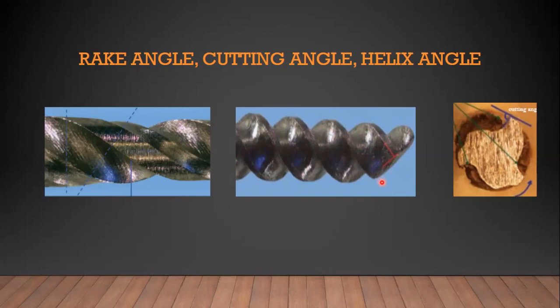Now, if the diameter of the file increases from the file tip towards the handle, the flute will become deeper, resulting in a core taper that is different from the external taper. Like Hero Shaper Gold, they are provided with a change of helix angle from tip to the shank, with the changing of taper of the file, and the pitch increases according to taper.